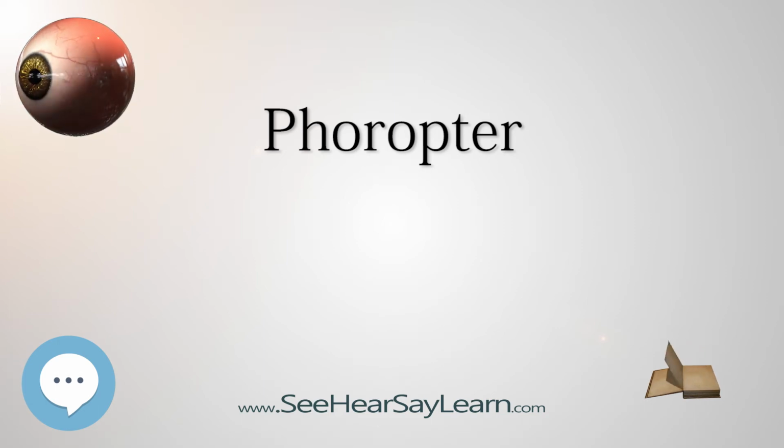History. The history of the phoropter, as a binocular refracting device which can also measure phorias, ductions, and other traits of binocularity, as distinct from the monocular optometer, which cannot, starts in the mid-1910s, with the introduction of the skioptometer by Nathan Shigan, and the phoroptometer by Henry DeZeng. These two inventions, as they continued to improve, were accompanied by a third device, the Green's refractor, which entered the market in 1934. European manufacturers were working on similar devices as well.